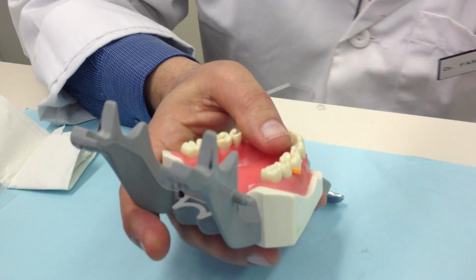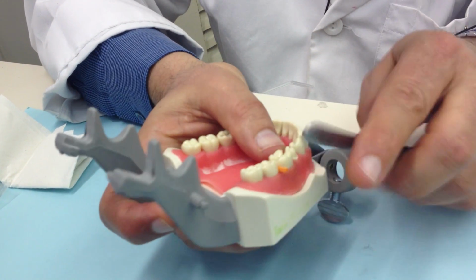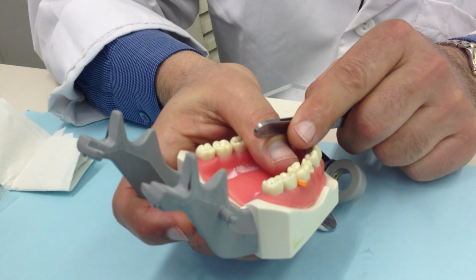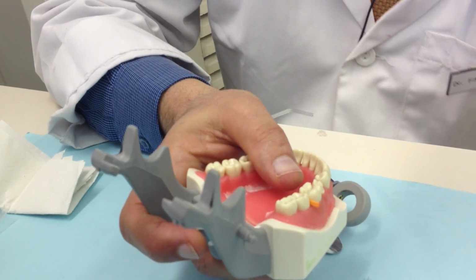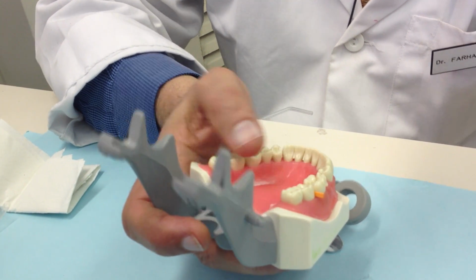Now, the wedge is the tightest when it is halfway through. Now, this is basically halfway through. If your wedge goes all the way to this side, probably it is a small wedge. Or if it does not go, or just one third of it goes inside, then probably it's too big. So you have to be sure.